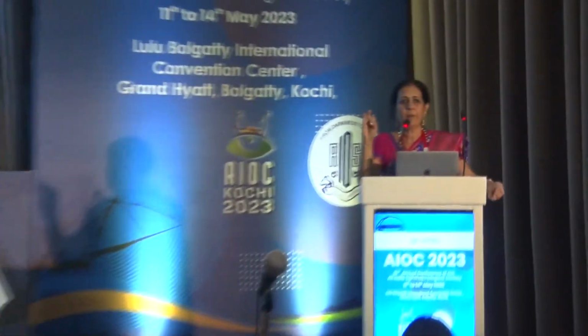I think counseling was very, very important, because the patient will be very dissatisfied. Counseling is very important. Your IOL power calculations can go a little haywire. You might end up with a little hyperopia.